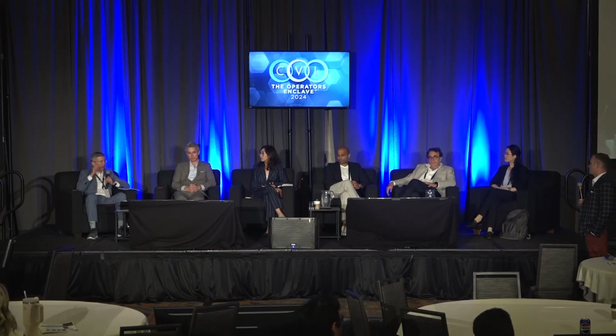And how did you ensure you're aspirating as much as you're infusing? Did you have somebody pushing, somebody pulling? We had two people going and just trying to do an equal rate of infusion and aspiration. When you're on live echo, we could see the volume of the appendage changing a little bit, so you could see if it was sucking down, then give a little bit more fluid. But we also wanted to make sure we didn't just blast saline in there and expand it so much that we lost our seal.